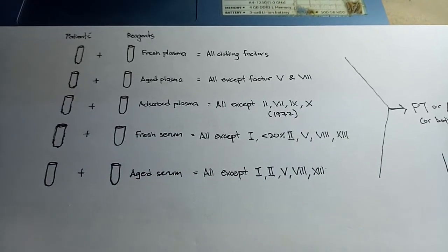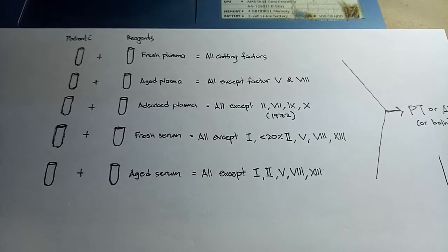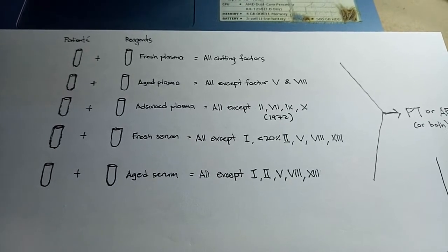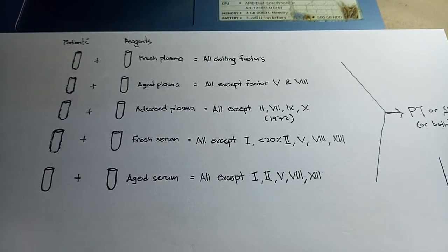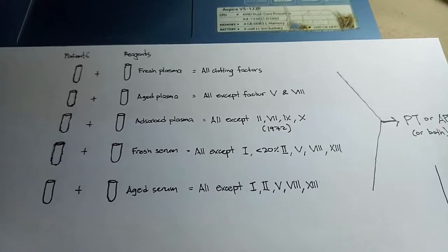So, kung after a while, if magtatagal or if the specimen is left unprocessed for more than 2 hours, mawawala na yung factor 5 and factor 8. So, ganun lang. Next is the adsorbed plasma.